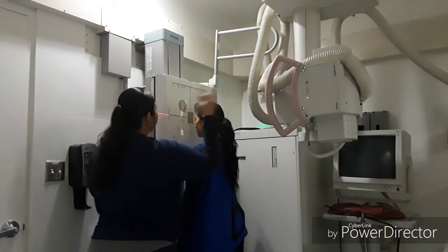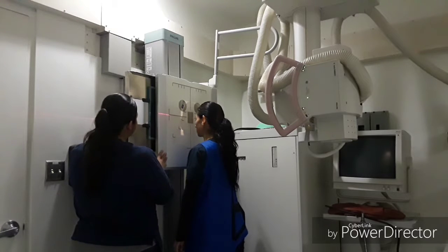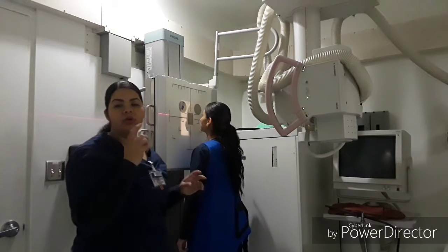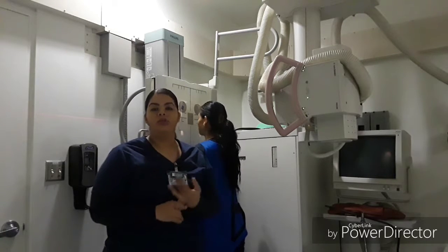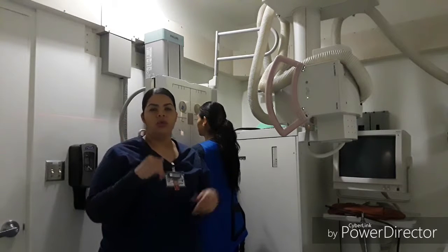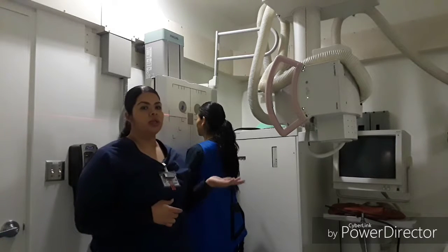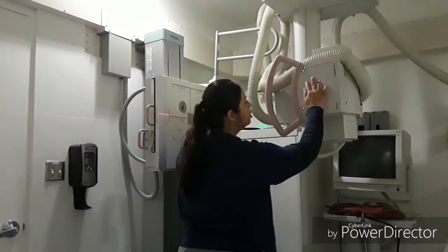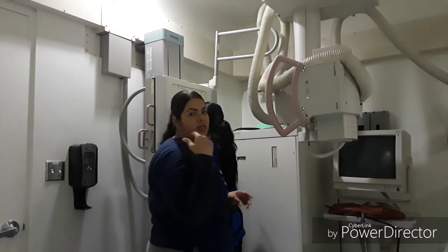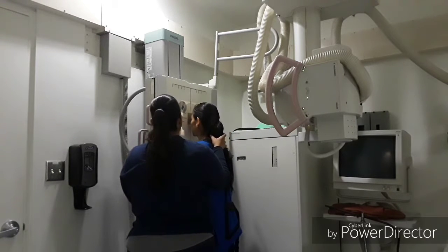My central ray is still coming in perpendicular, and for this projection, the patient is going to be resting the tip of their nose to the grid, because we want our OML to form 15 degrees with the central ray, and we want our midsagittal plane to be perpendicular with the IR. So like I said, the central ray is going to enter perpendicular, and it should enter horizontal and exit at the nasion. Could you move your chin forward just a little bit like that?